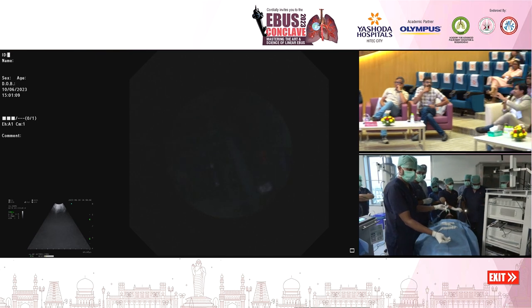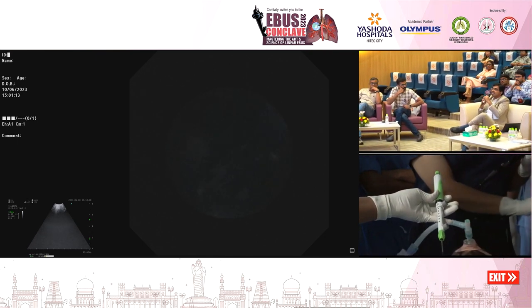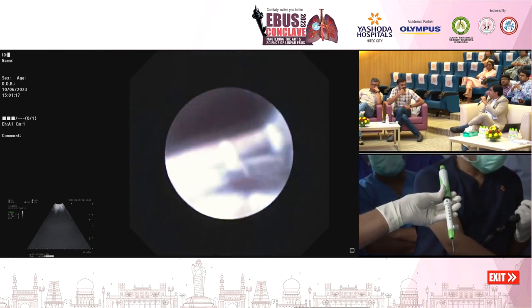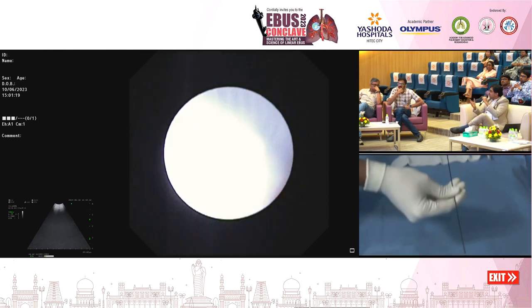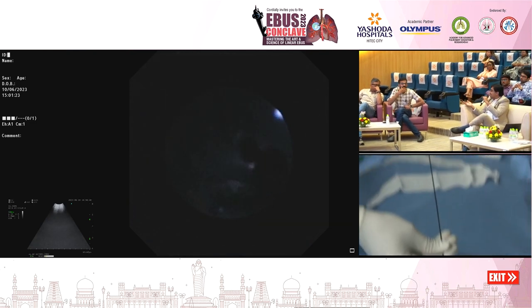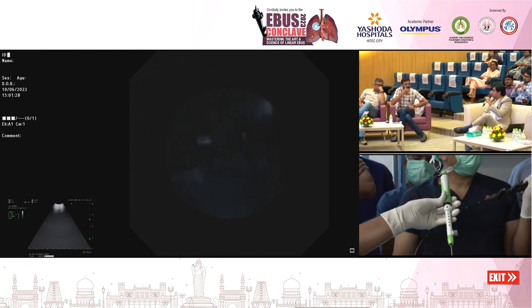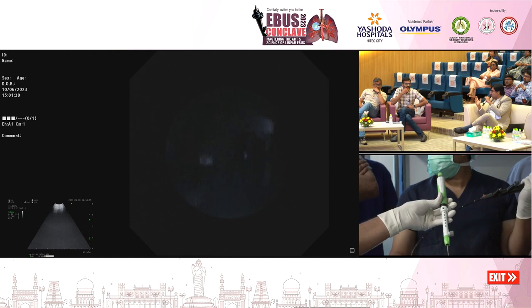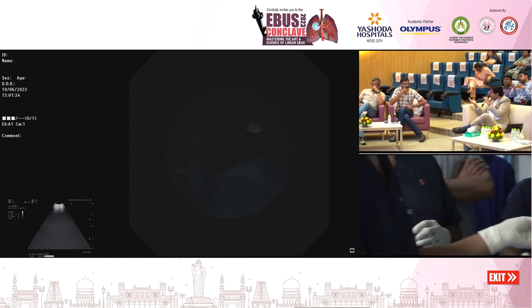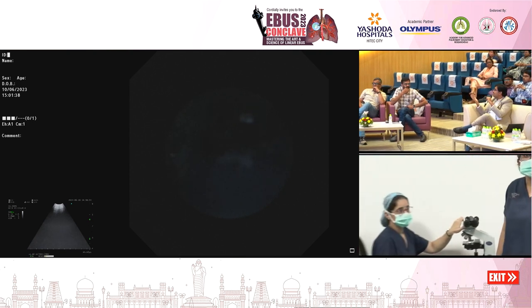If this is more for demonstration, we are doing all these things, but when you do it on a daily basis, it is not essential that you do biopsy for everybody. This is something which we should learn. Because we have a ROSE, if the pathologist says there are granulomas, then we are happy, we don't have to do any biopsy. If they say there is a good number of malignant cells, again we don't do a biopsy. When there is no diagnosis, or if there is malignancy but scant atypical cells, we tend to do a biopsy.